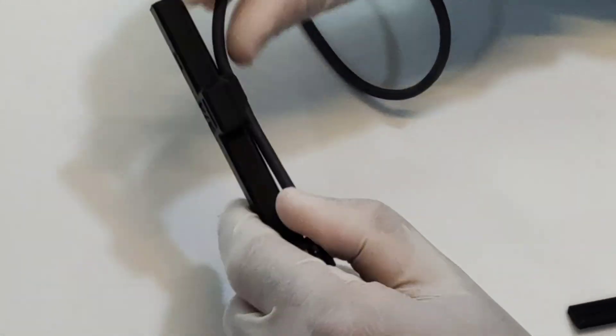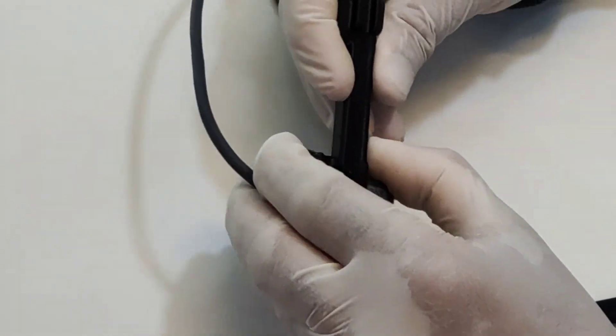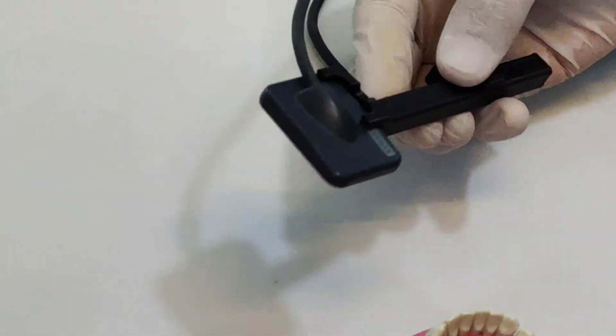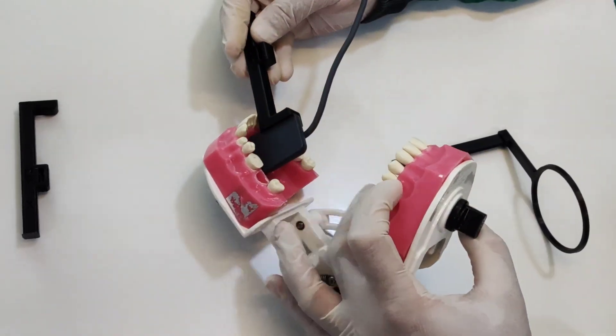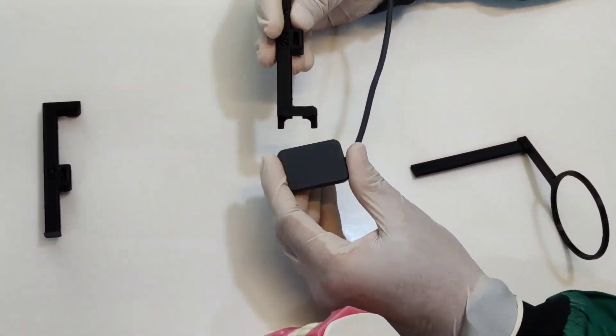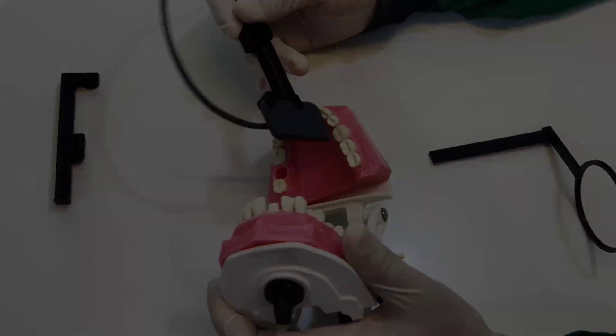Here is one more method or trick to use this RVG holder. You can place it on the sideways of the RVG, and this can help you place a single tooth X-ray better at a greater depth. It will be very useful for premolar curvature X-rays. You can use this for both upper and lower quadrants, and this connector is going to help you place it perfectly, easily, and comfortably in the patient's mouth.